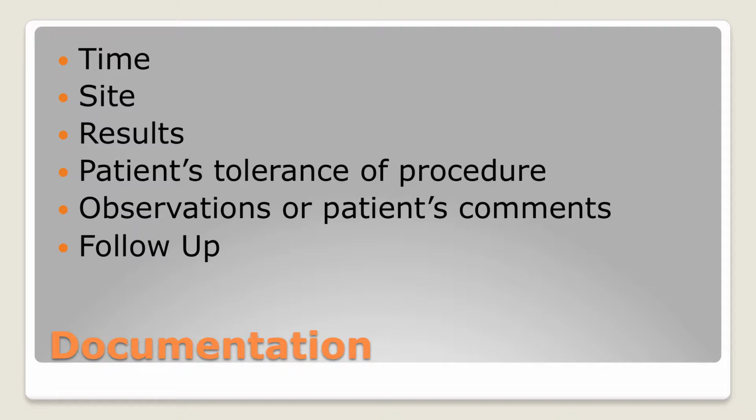Document what the results were, whether or not the patient had any difficulty, if it continued to bleed or if the bleeding stopped immediately. I'm really not a big fan of "patient tolerated the procedure." I think that that'll get you in court someday. Document any observations, anything that you think is pertinent, and any comments that the patient's made, any follow-up.